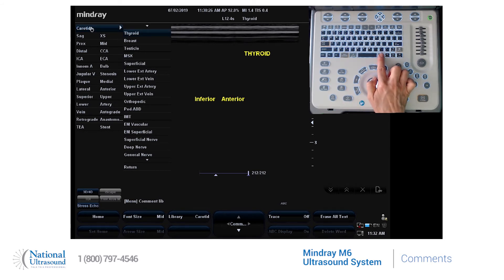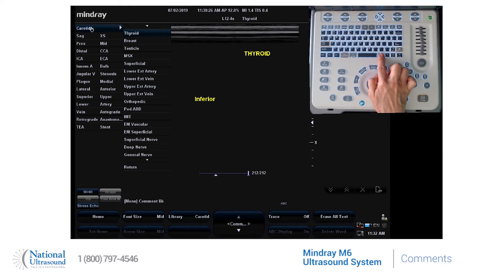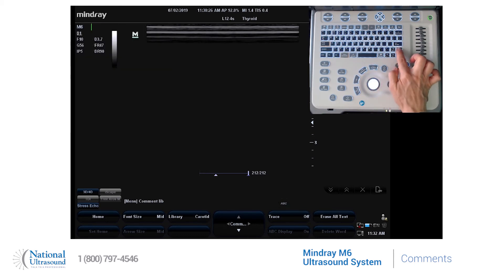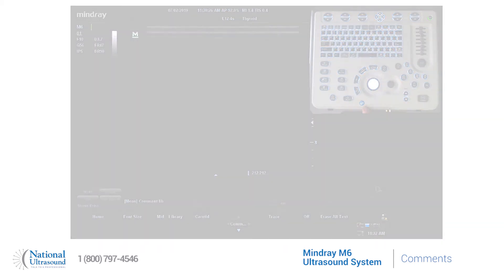If you press the clear button to the right of the spacebar, a quick press of it will delete the last word and then the next last word. If you hold down on the clear button, it will clear all the terms off the screen.